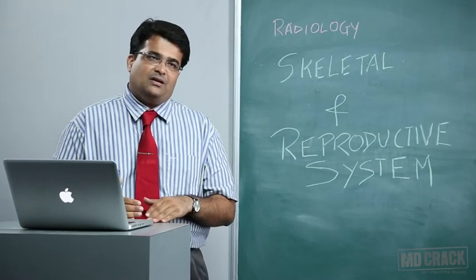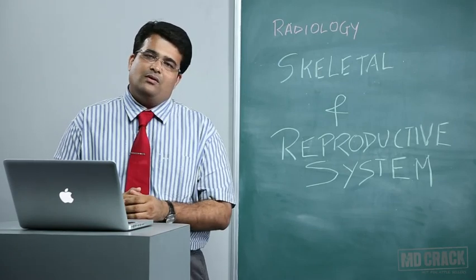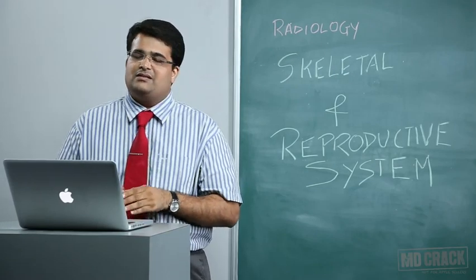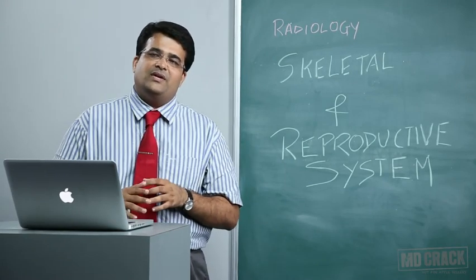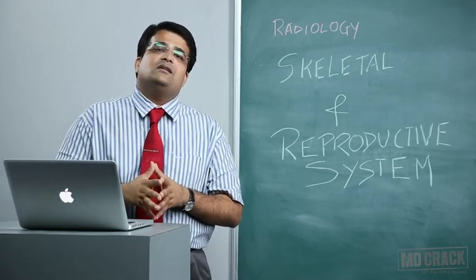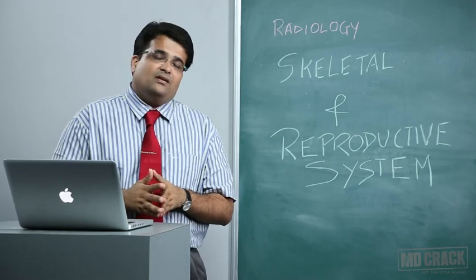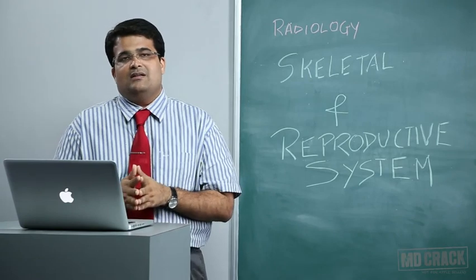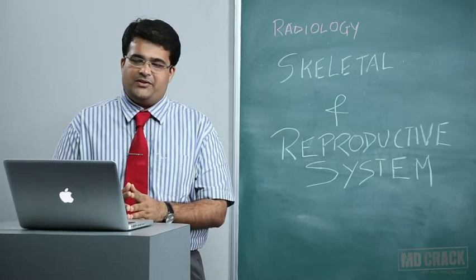Let me just recap spine and the musculoskeletal system. So each modality once again has its own role, and even if you have high-end investigations like MRI, CT, your X-rays are indispensable. So you have to begin your imaging with X-rays, because there might be quite subtle findings like calcification, which might be easily missed maybe on ultrasound or even on MR. And of course, when we're talking about the spine, even though the X-rays are normal, that does not rule out any other pathology within the spinal canal, like small disc bulge or small disc protrusion. They can be a severe cause of pain to the patient.